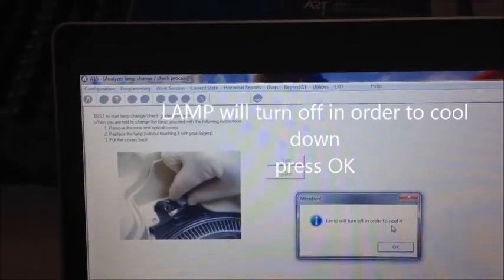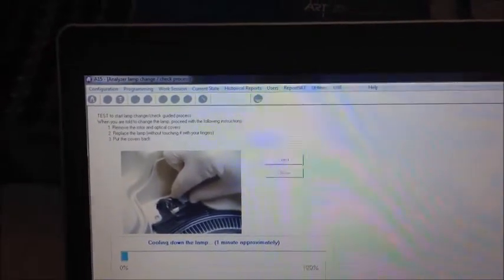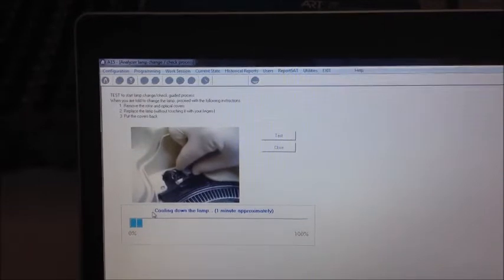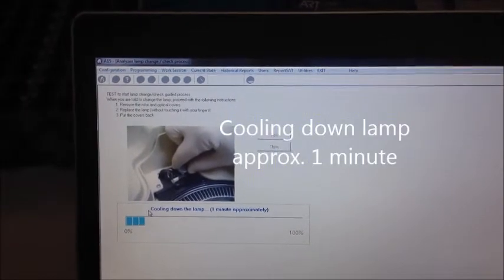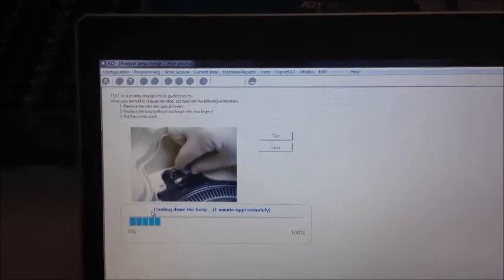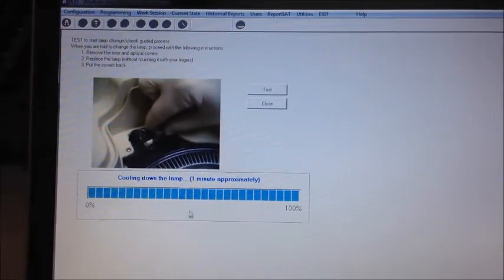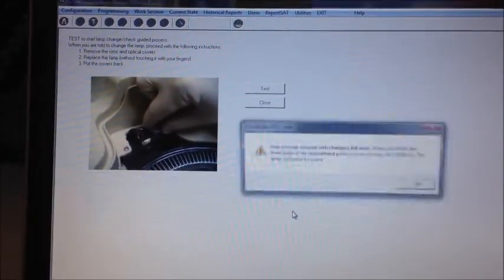The analyzer will go to sleeping mode. This will allow the lamp to cool down. After approximately one minute, the analyzer is now ready to change the lamp.